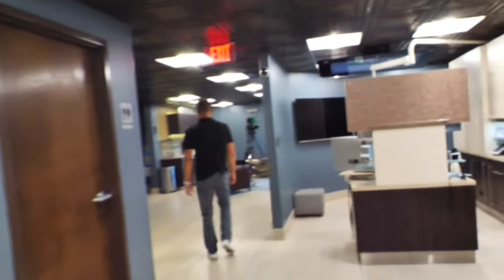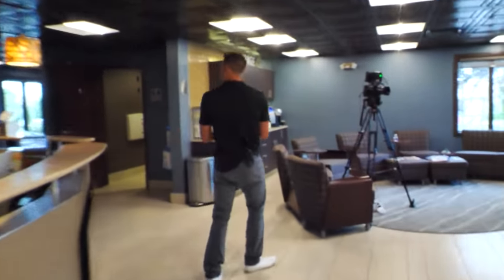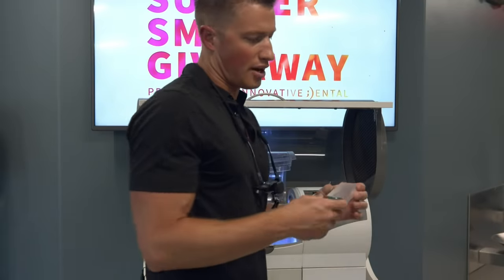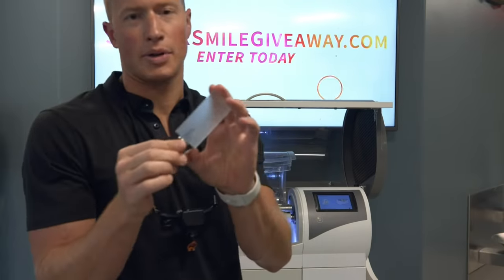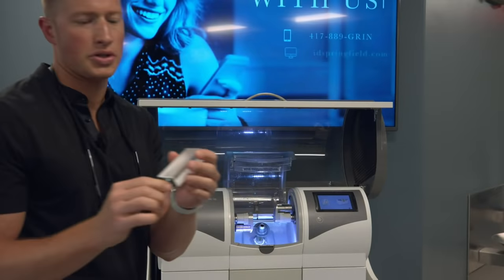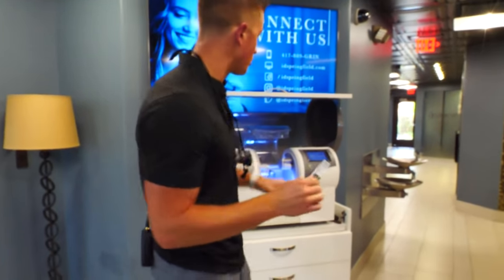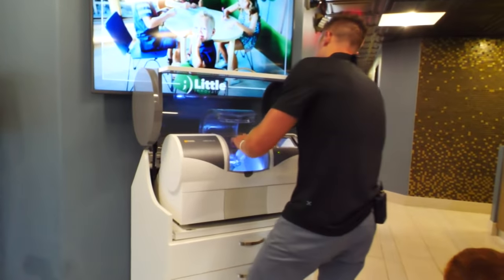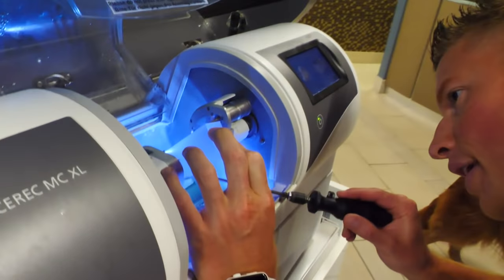All right. So we're heading up to the front of the lobby here. Hey guys, have a good one. So in our lobby, you'll see we have a clear guide, that block that you just saw placed in the software back there. That's this block right here. And this is what we're gonna use to mill out our guide. And so this machine here will use some carbide burrs and it'll cut out all of those dimensions. I believe this one will probably take, if I'm betting man, which I'm not, but I'm guessing 35 minutes or so.